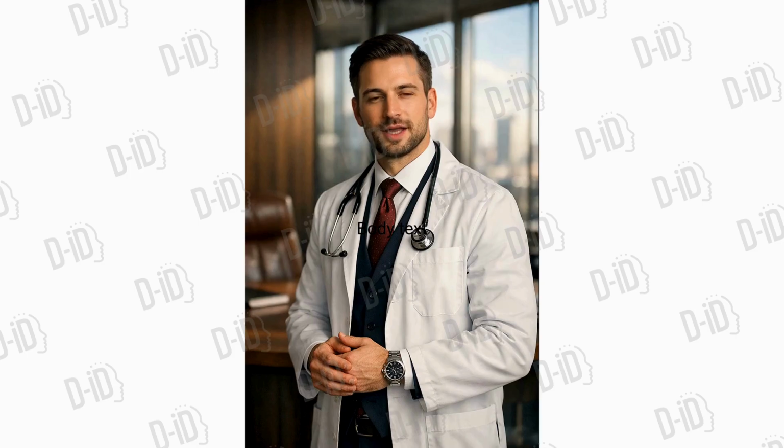A patient comes in with sudden vision loss. Your scan shows a detachment, but which one? Retinal, choroidal, or vitreous? Pause, because that decision changes everything.